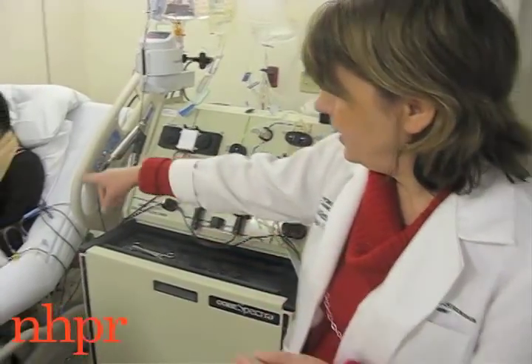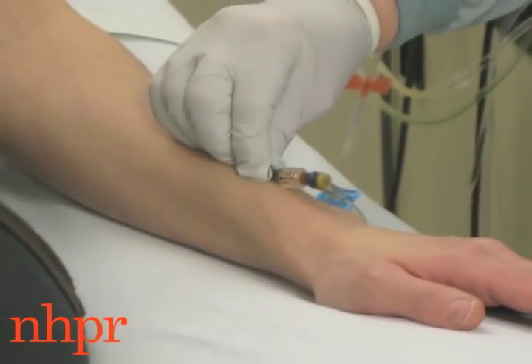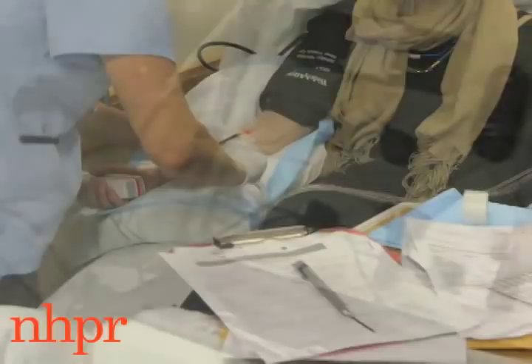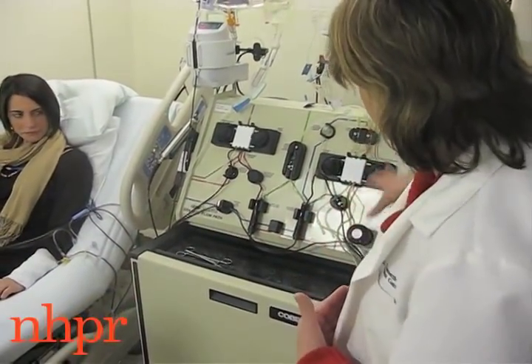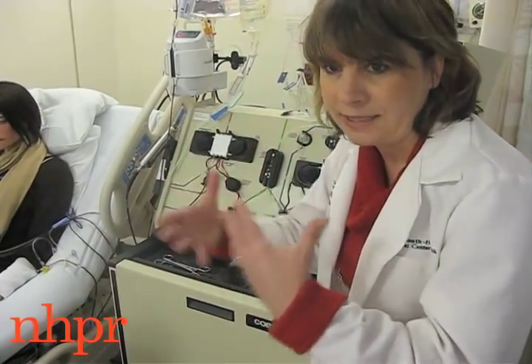We have blood coming from Emily on that side, so the blood is being drawn from her and all of it is going through all of this tubing. Her blood is being drawn out of her body and into this machine, and this tubing is all just processing everything.